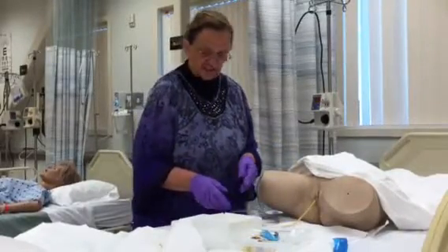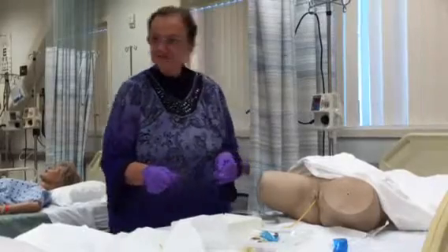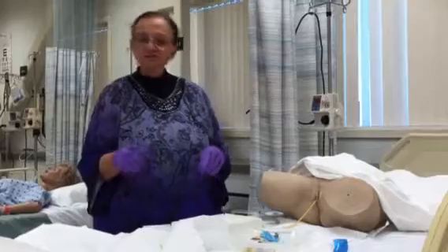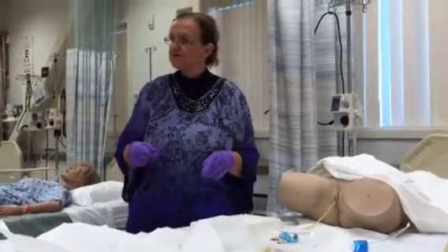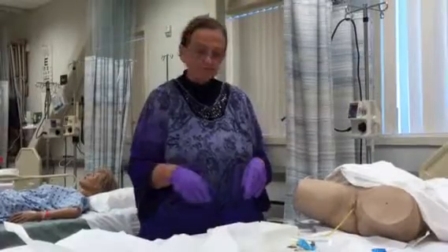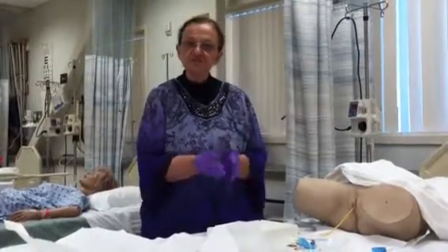For my documentation, I would put that a 14 French Foley catheter was inserted to the bladder. I had a return of 240 milliliters of clear yellow urine, and that's basically the procedure. Thank you.